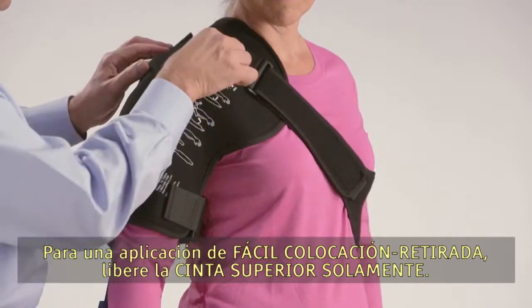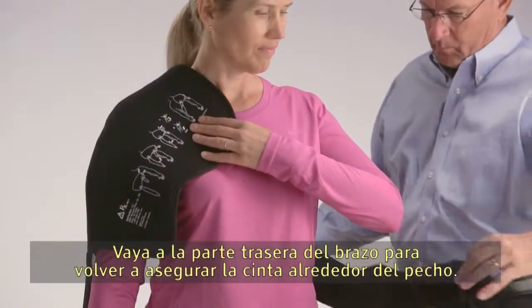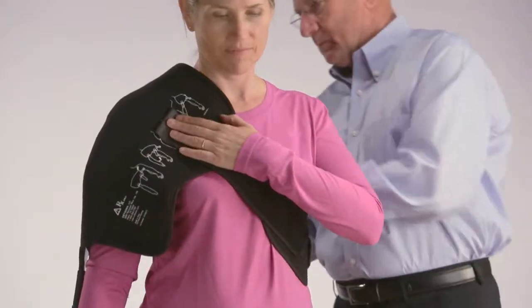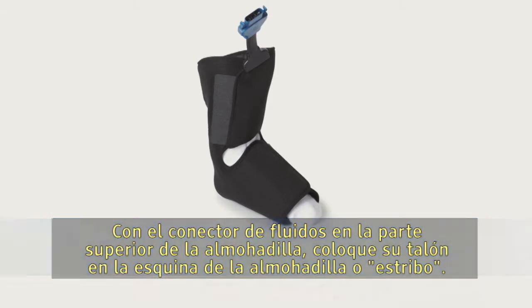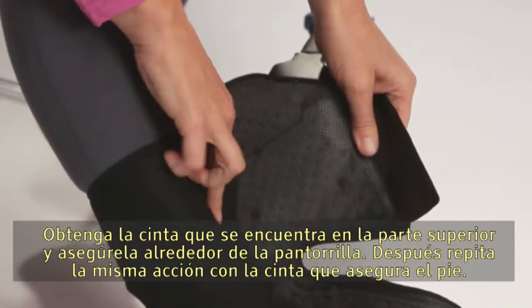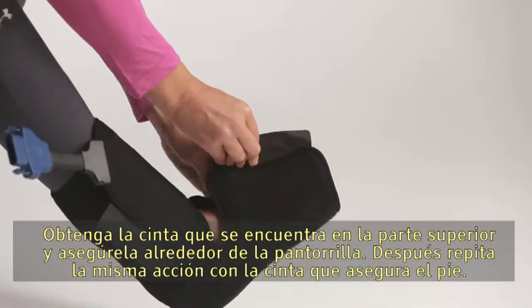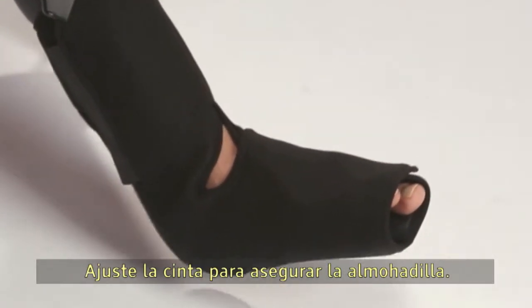For easy on and off application, release the top strap only, then reach behind you to resecure the strap across the chest. With the fluid connector at the top of the pad, place your heel in the corner of the pad or the boot. Take the strap located at the top and secure it across the calf, then repeat the same action with the strap that secures the foot. Tighten the strap so the pad is secure.